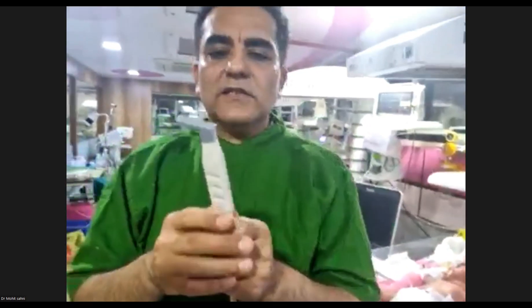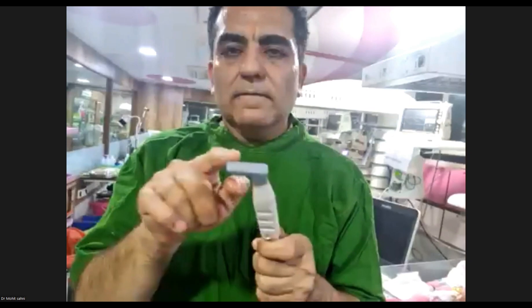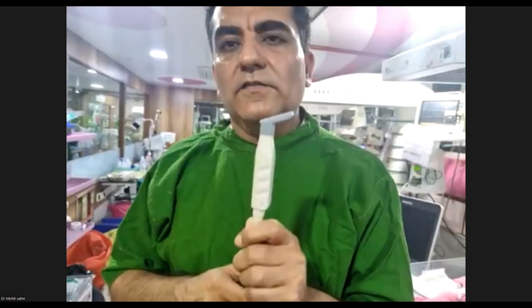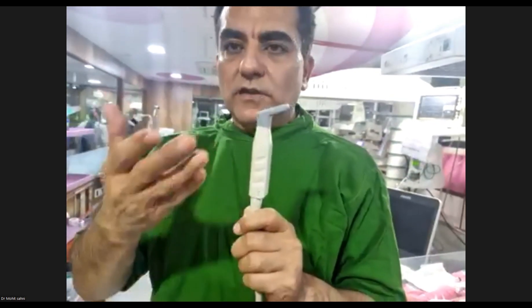This is a hockey stick probe — essentially a linear array probe for newborns. The footprint is very small. It has a higher frequency of 15 to 20 MHz. We use it for lung ultrasounds, vascular access, central lines, nerve blocks, superficial and subcutaneous findings, abscesses, and NEC. For subcortical white matter visualization, this linear probe gives a much clearer image than a phased array head ultrasound probe.